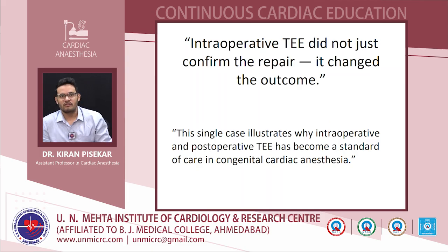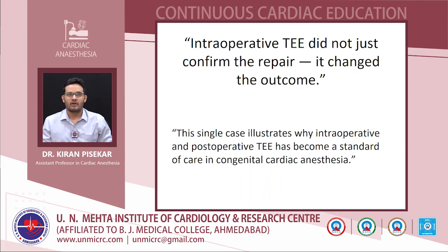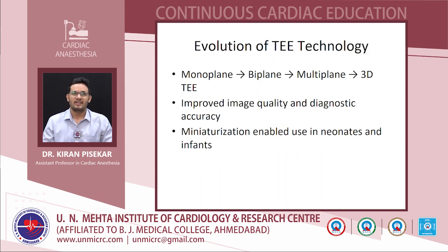If we didn't have TEE, the patient would have shifted to ICU, and on post-op day 1 or 2 we would have diagnosed the residual VSD, and then there would have been a plan to repair, or it wouldn't have been. But we had TEE in the intraoperative period and it changed the diagnosis. We directly went on pump, and at that particular time in that setting we had a change in outcome. So TEE is essential in congenital and pediatric cardiac surgery. It can be used intraoperatively or postoperatively, and it gives a real-time anatomical and hemodynamic assessment.